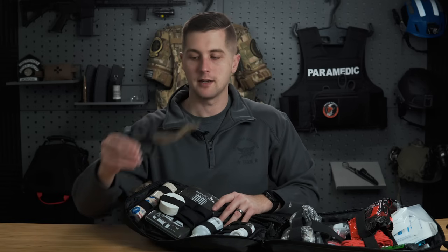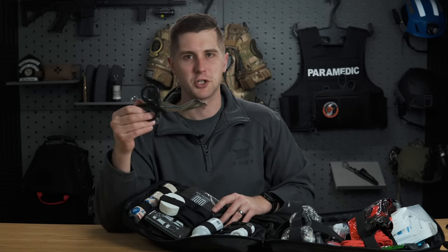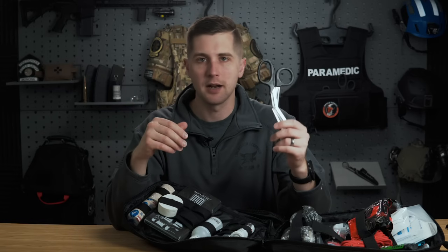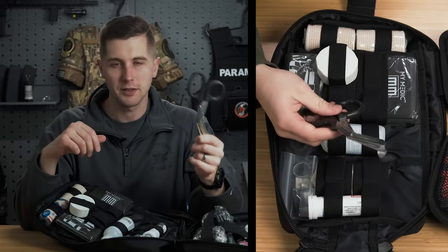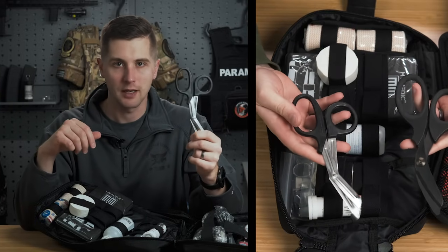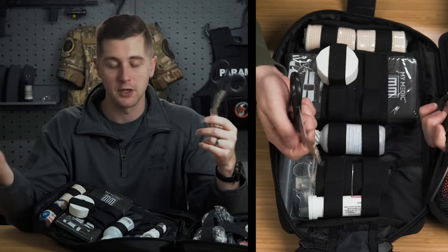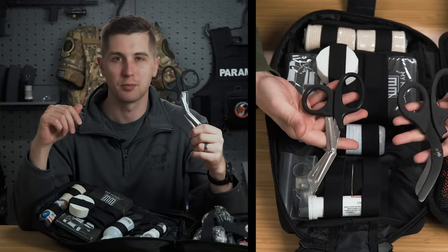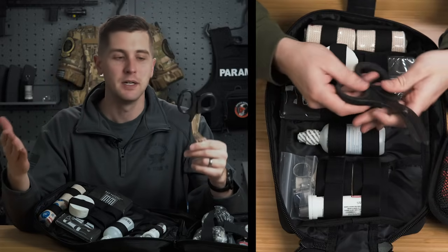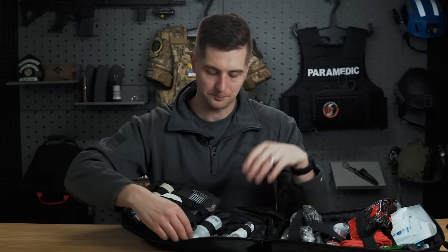And then next to that, you have some trauma shears. These will be fine. These are cheap, like $1, $2 trauma shears, which is what 99% of EMTs and paramedics are using. Just be aware that when you use this once, it will be too dull to use again, really. So I replace all my trauma shears with X shears. That's kind of my go-to when it comes to that. But if you're only gonna be using it once, you're probably gonna be using it a little less than I am, these will work just fine for you and there's nothing wrong with them.